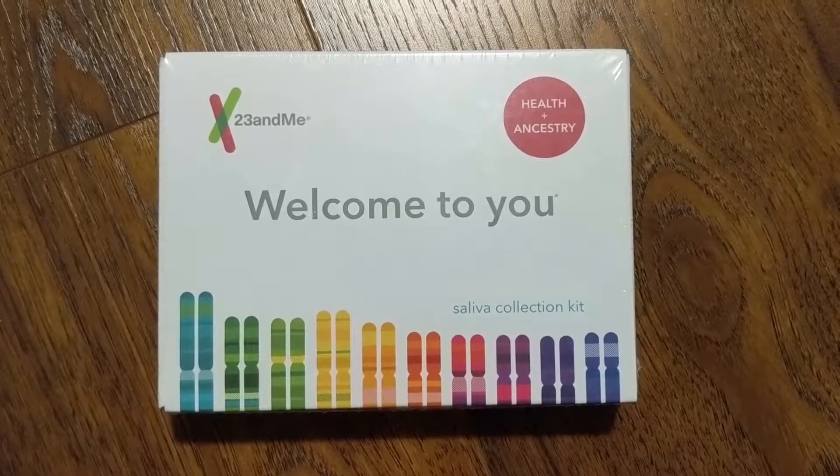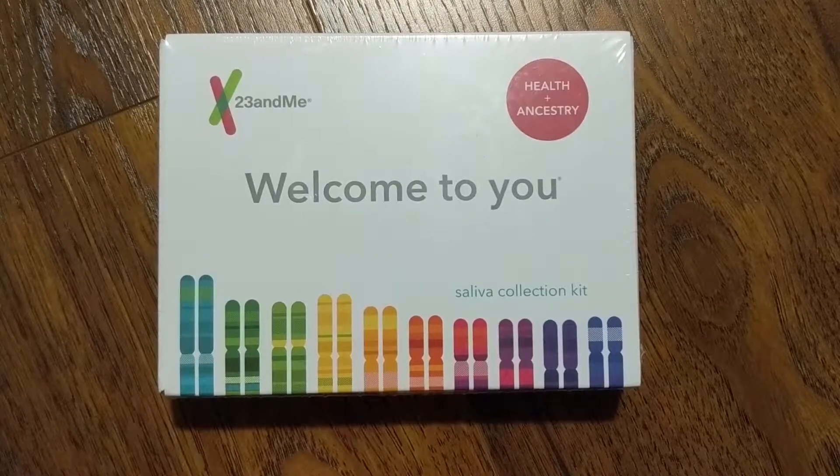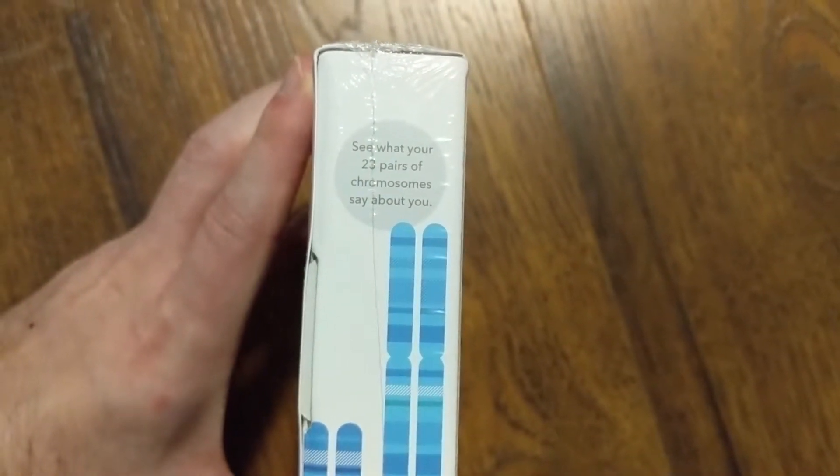All right, here we have it — the 23andMe Health and Ancestry Saliva Collection Kit. It says, welcome to you, and it's got a pair of chromosomes. It says, see what 23 pairs of chromosomes say about you.